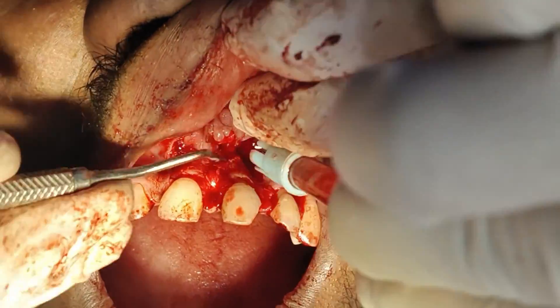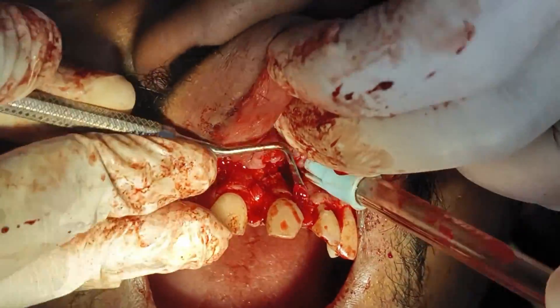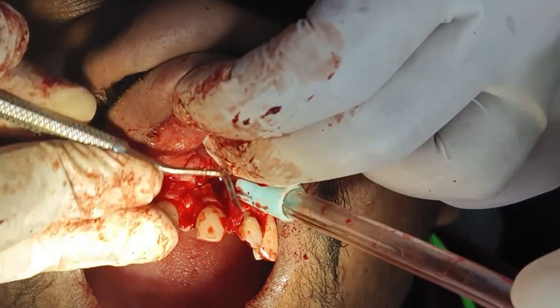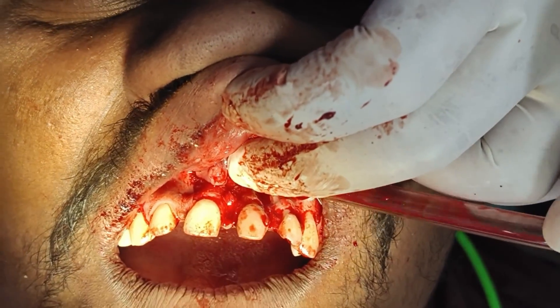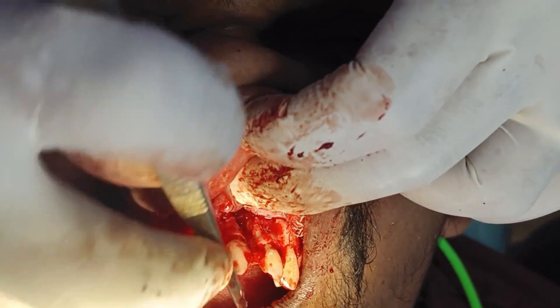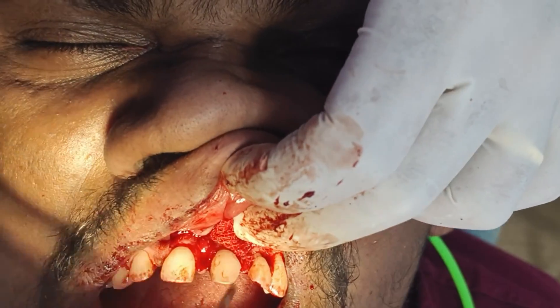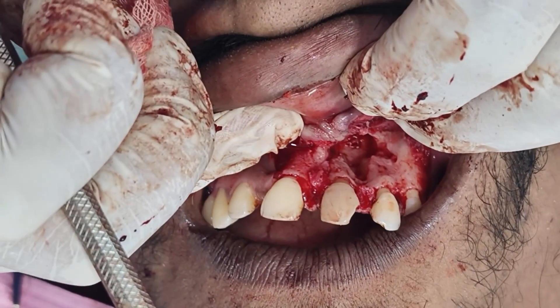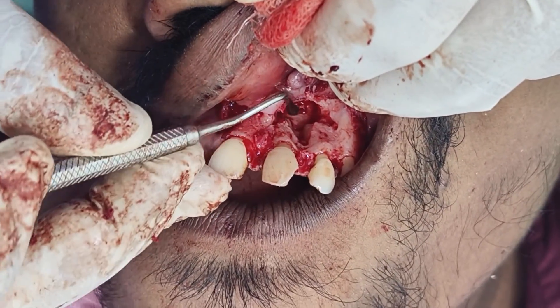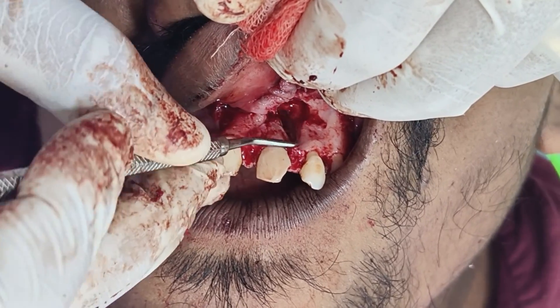Do curettage and irrigate with saline. Now we have removed the cystic lining and you can see the bony cavity. To confirm the cyst lining is removed, we curettage like this and you will get the sound of fresh bone. There is no bleeding now, so it's clean entirely.